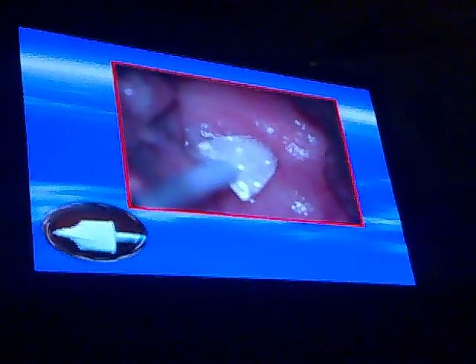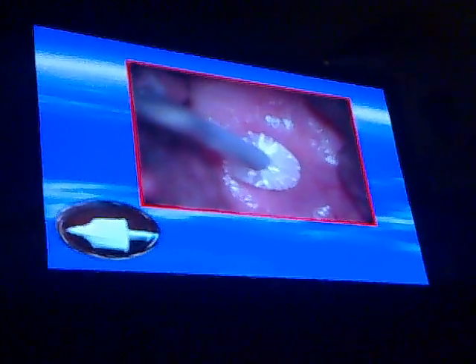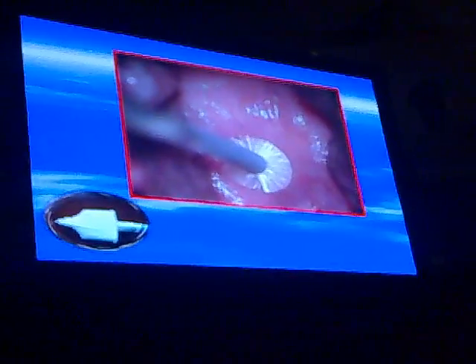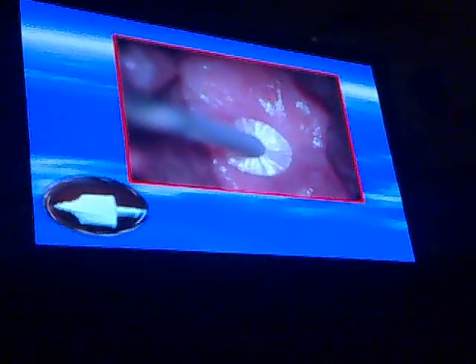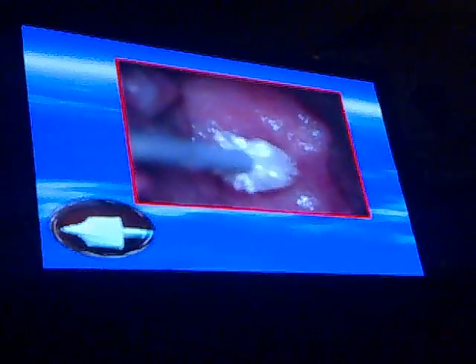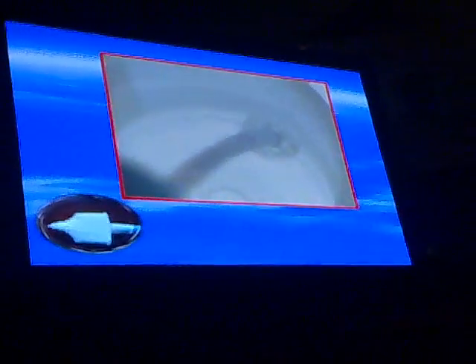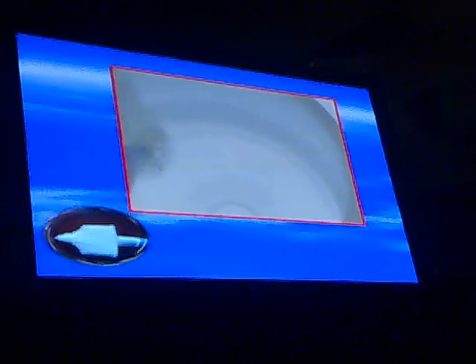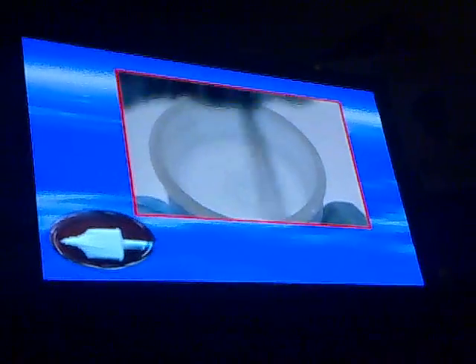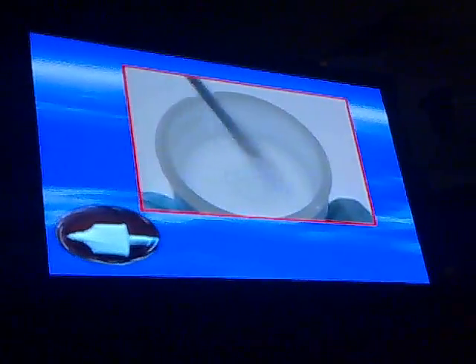Next, obtain a sample from the endocervix by inserting the endocervical brush into the cervix until only the bottommost bristles are exposed. Slowly rotate the brush 1/4 to 1/2 turn in one direction to minimize bleeding. It is very important not to over-rotate the brush. Rinse the brush in the same preservative vial used for the spatula. Press the bristles of the brush against the wall of the vial while stirring the solution 10 times. Then swirl the brush vigorously to further release cervical material. Once rinsed, the brush may be discarded.